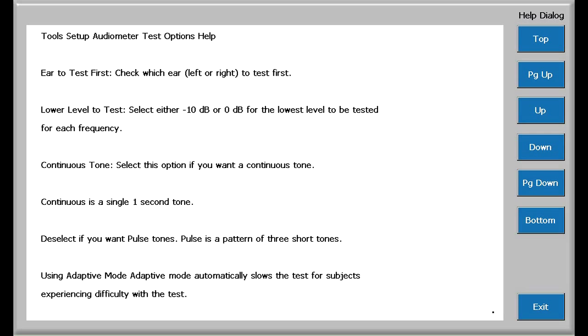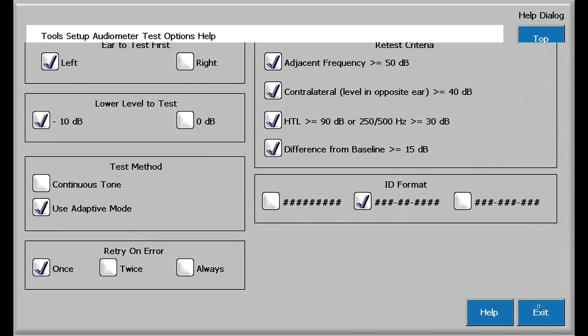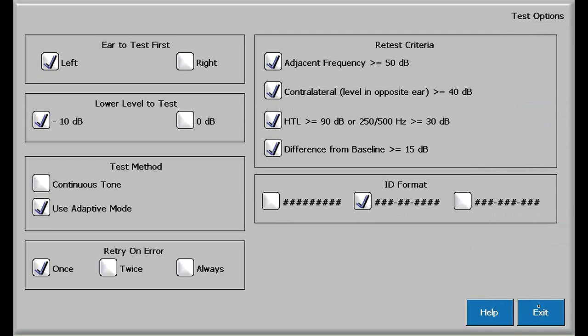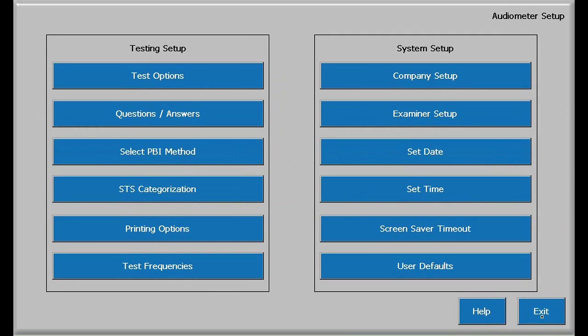The Help button provides context-sensitive information about test options. Press Exit to leave this screen, and press Exit once again to leave the test options screen.